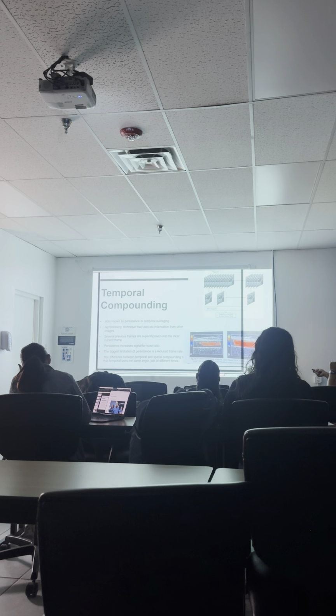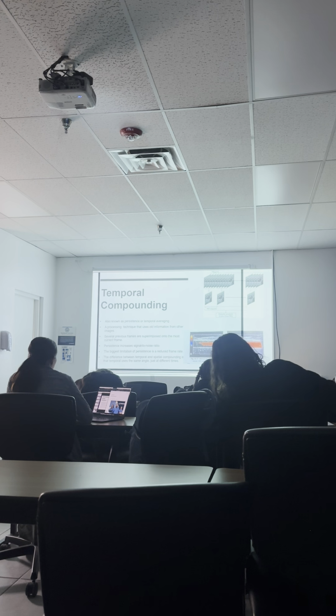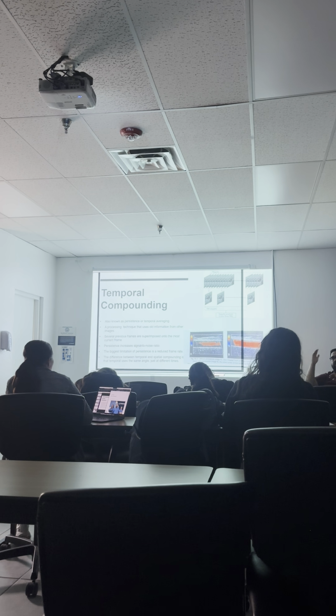Okay, so temporal compounding, also known as persistence or temporal averaging, is a processing technique that uses old information from other images. From the moment we put the probe on the patient to the moment we freeze, it's going to use all of those frames and put them together to make a better image.